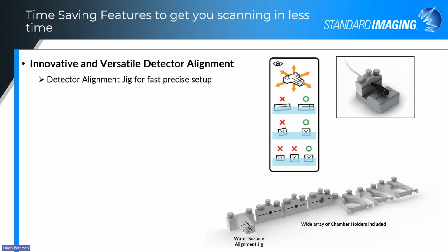And then once you are aligned, you see up in the upper right, there's a chamber mount system, which basically you set your chamber up, and that build-up cap with the line on it aligns to the line on the block. Then you just tighten that up, secure that in the holder, move that to the chamber mount in the phantom, and it places it right at the exact point you need it for scanning. So it's a very quick and easy setup for the chamber positioning as well.